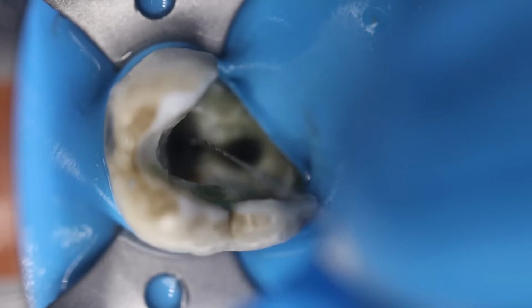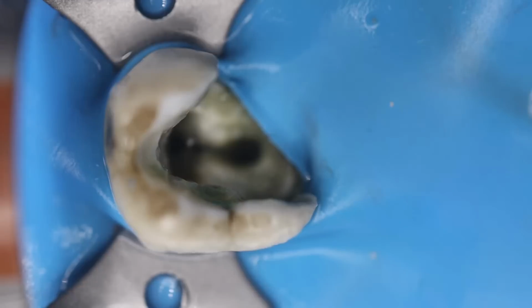Then clean up the file and engage it into the mesiolingual canal. It goes easily into the mesiolingual canal, and now again into the distal aspect.